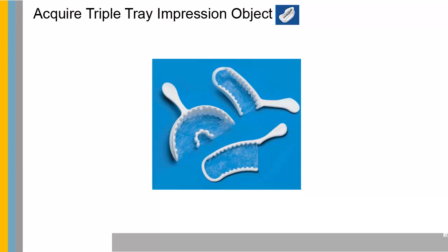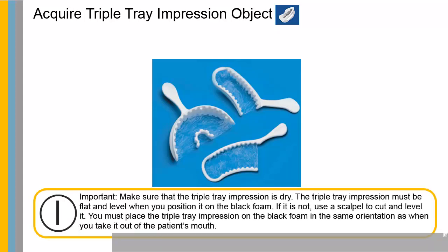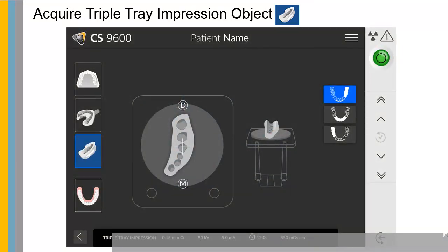Click to launch the triple-tray acquisition. Make sure that the triple-tray impression is dry. The triple-tray impression must be flat and level when you position it on the black foam. If it is not, use a scalpel to cut and level it. You must place the triple-tray impression on the black foam in the same orientation as when you take it out of the patient's mouth. Select the triple-tray impression acquisition mode. See the on-screen illustration on how to position impressions at the center of the black foam. For posterior restorations, place impressions with the mesial surface at the front end of the black foam.